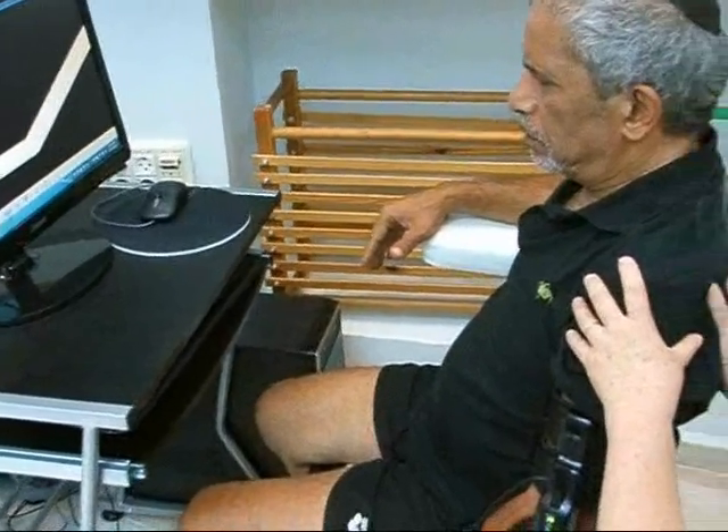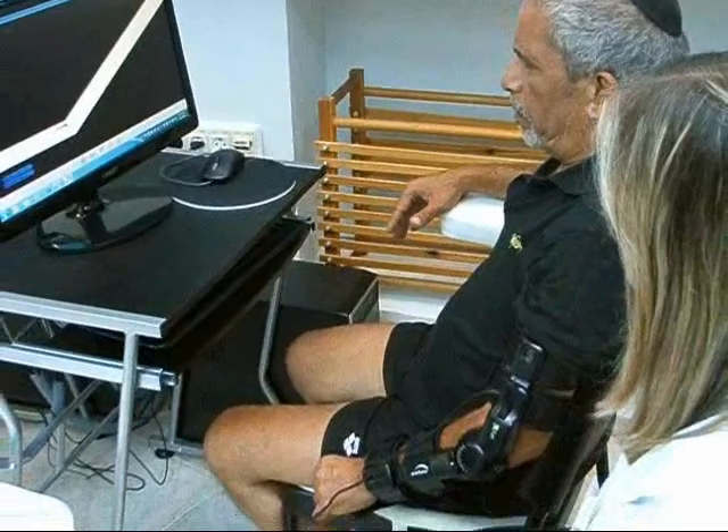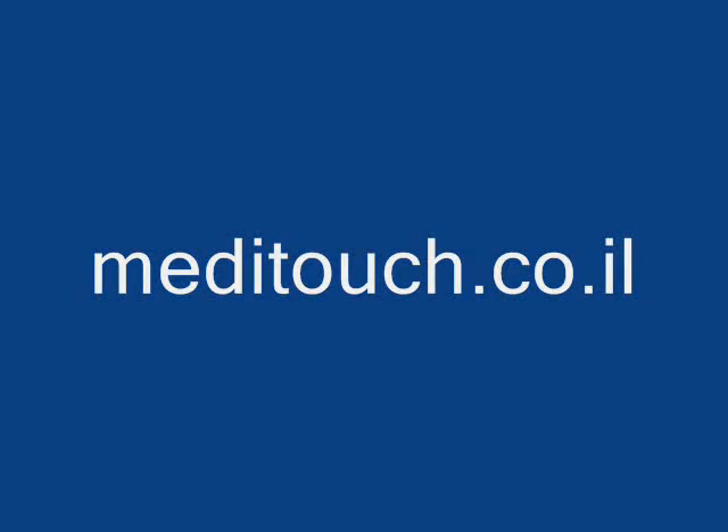The patient can use the Arm Tutor in the clinic and home environment, and the Arm Tutor system provides objective and quantitative evaluations on the patient's treatment progress. For more information, please visit the MediTouch website.